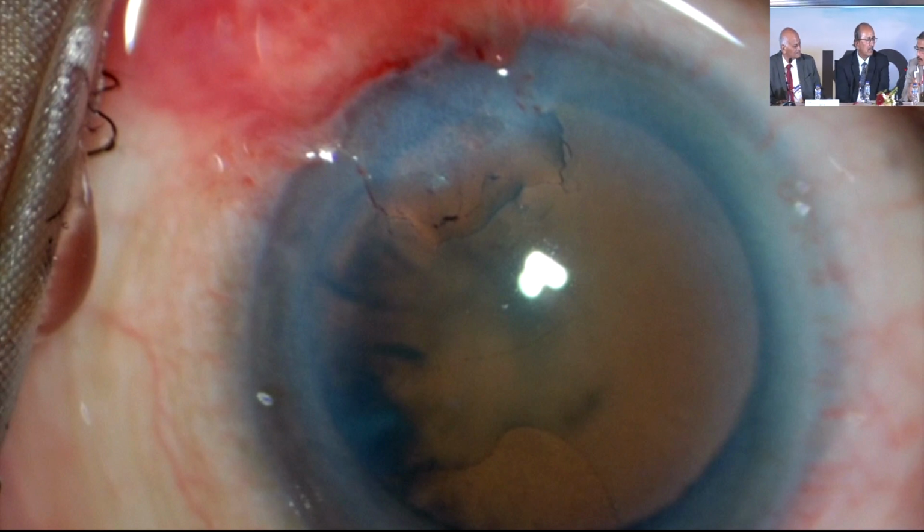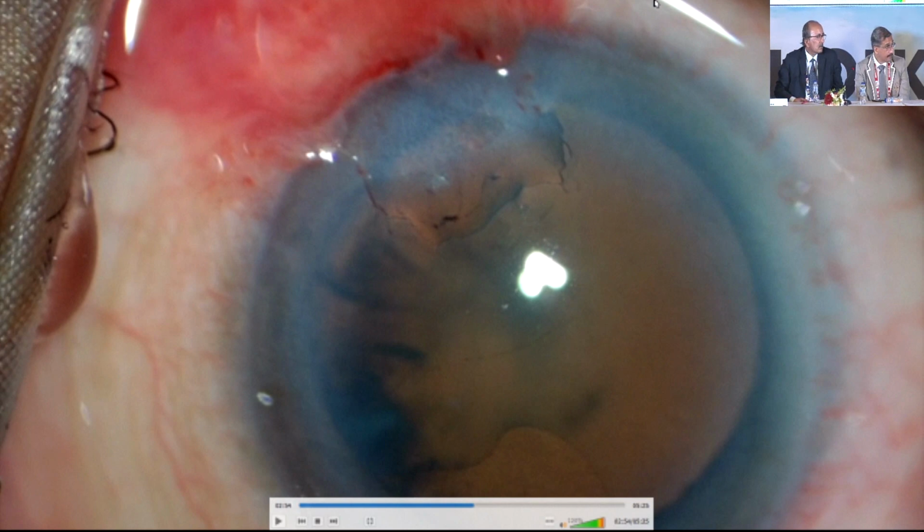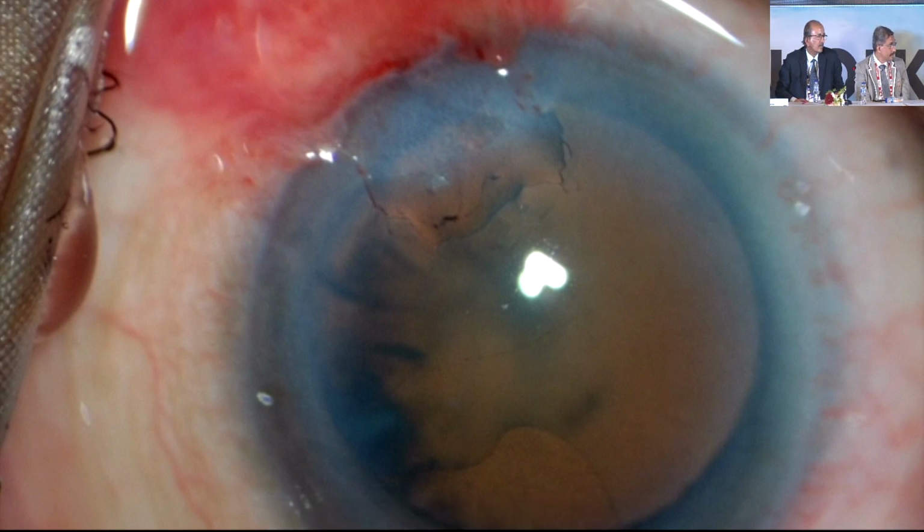Same, sir. First is to see that whatever vitreous has come in the front is first dealt with, then do the cataract. You want to add anything? No, same, sir. There was one point.